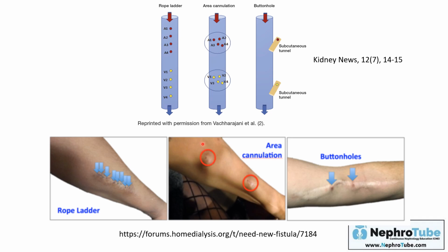So cannulation of the same area different times is considered a faulty technique. We have to use the rope ladder technique or buttonhole technique, as we mentioned, according to the available indications.